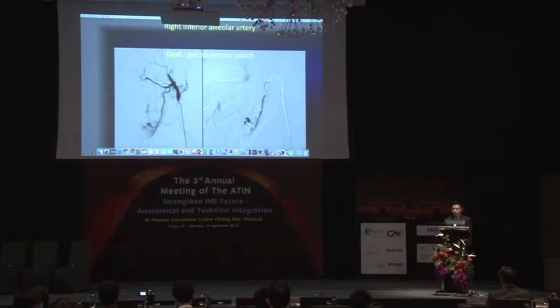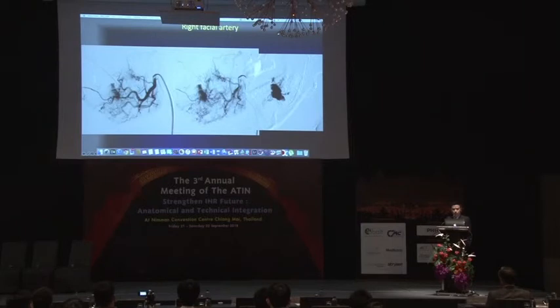and another arterial feeders. The aim for this disease is we need to close the venous pouch, because if we leave it, the patient will bleed again. So we tried transarterial embolization of these feeders. For the right facial artery, we used glue. So you can see the glue here in the facial artery, in the venous pouch, in the mandible.